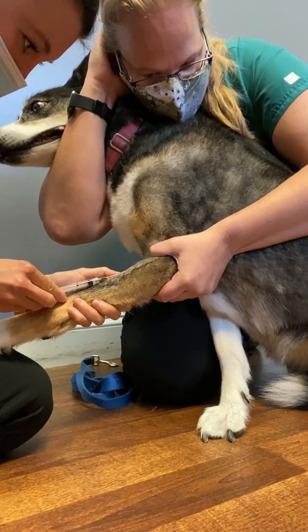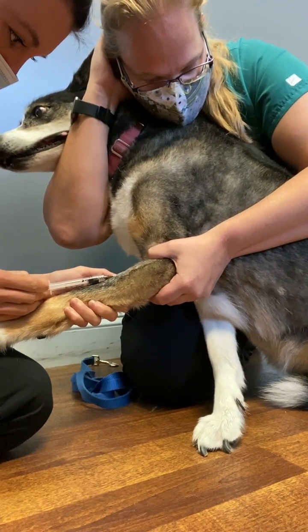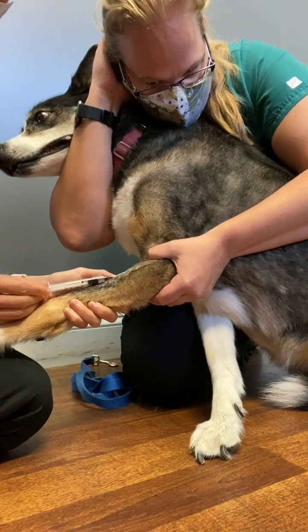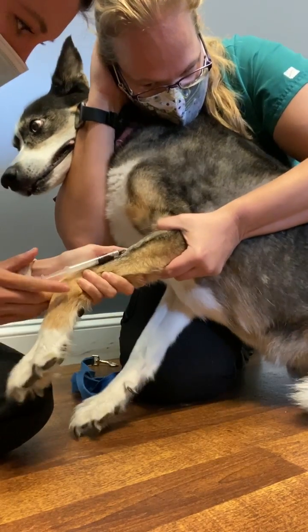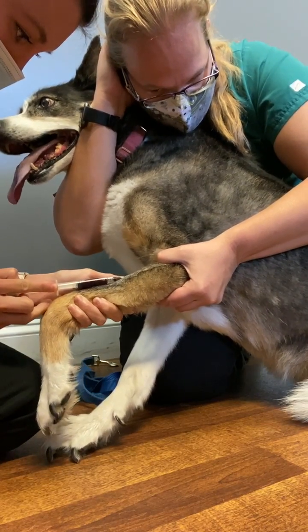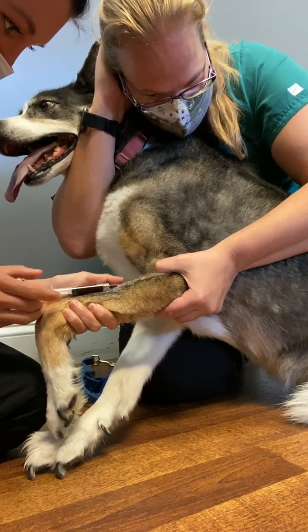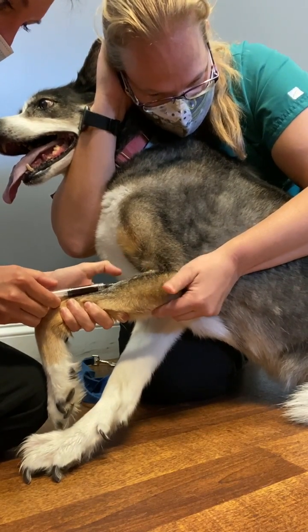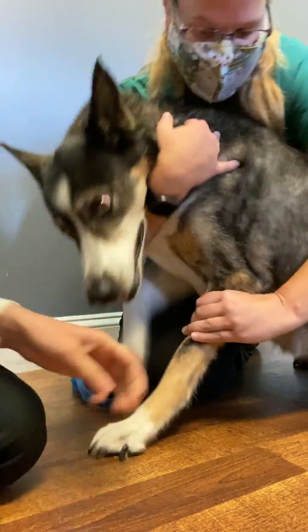I'm going to go ahead and poke that vein, then pull back the plunger without collapsing the vein. I'm going to have my restrainer lift up, pull out the needle, and then place pressure where the needle was.